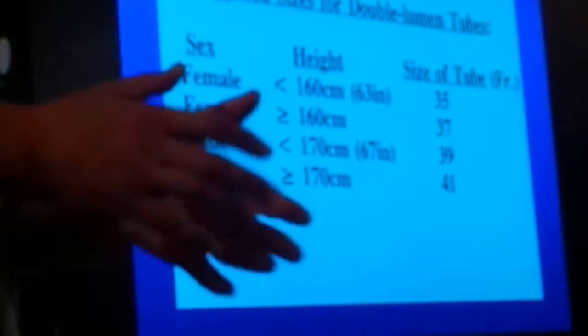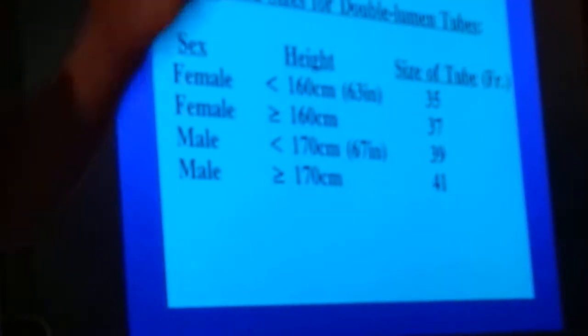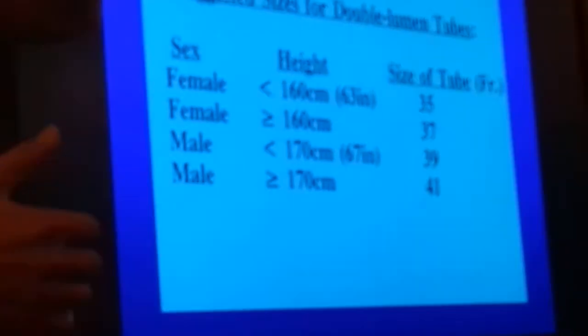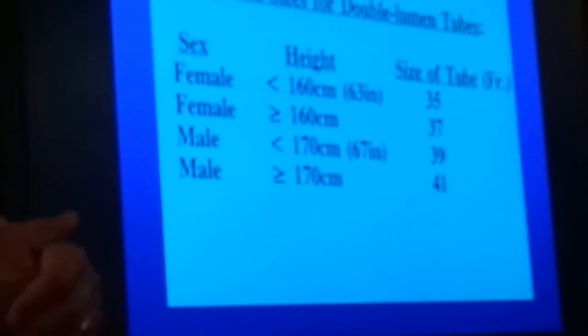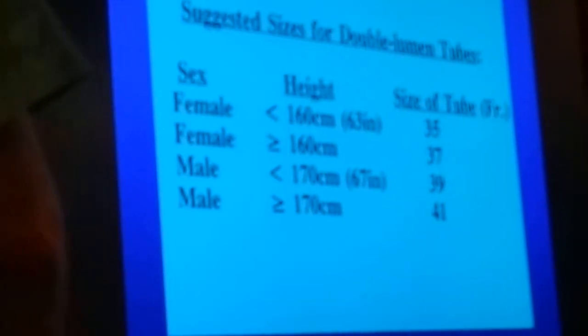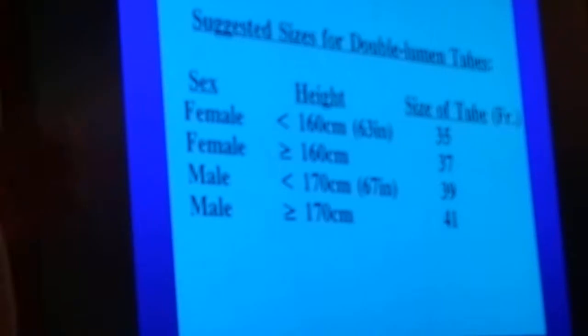Unless the female is too short or the male too short, then we have to use the lower size, or too tall, then we have to use the bigger size. But roughly, male 39, female 37.